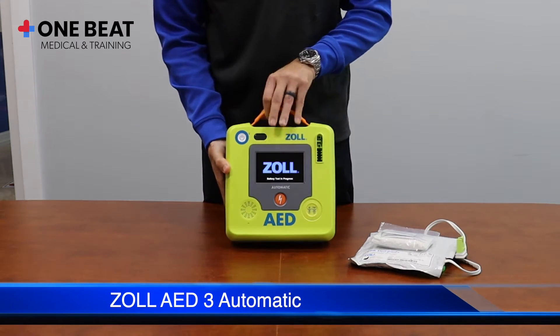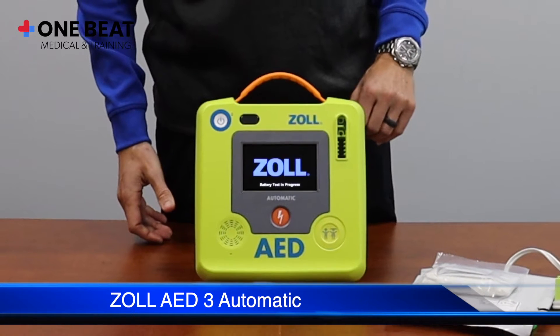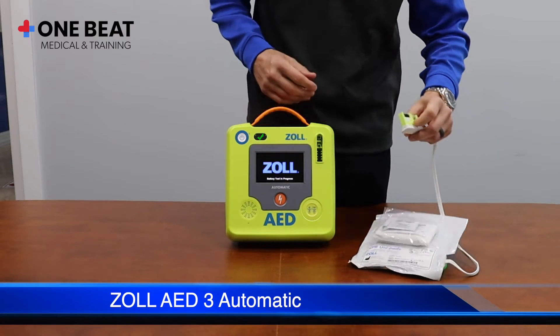This will immediately initiate a battery insertion test. Successful completion of the battery insertion will be indicated with a voice prompt of 'unit ok' and a check mark in the indicator on the top left of the AED.